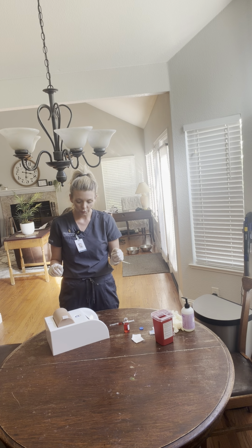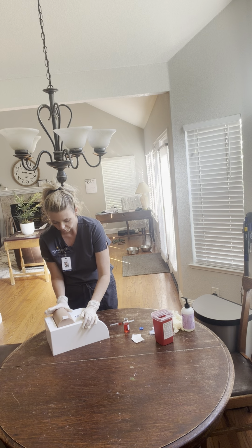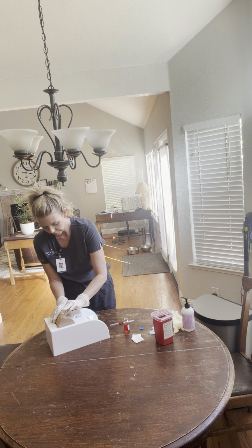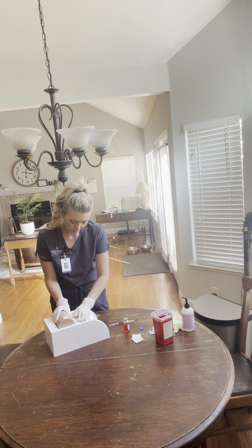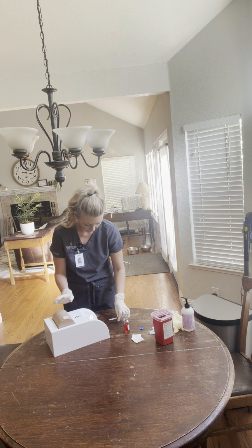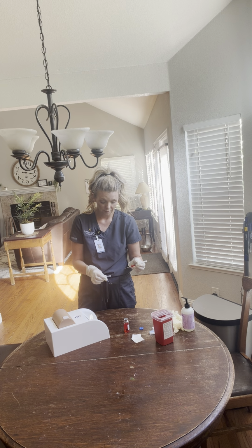I'm going to take my non-dominant hand, and I'm going to put that up against that, and I'm going to pinch down. Well, first I think I'm going to uncap my needle.